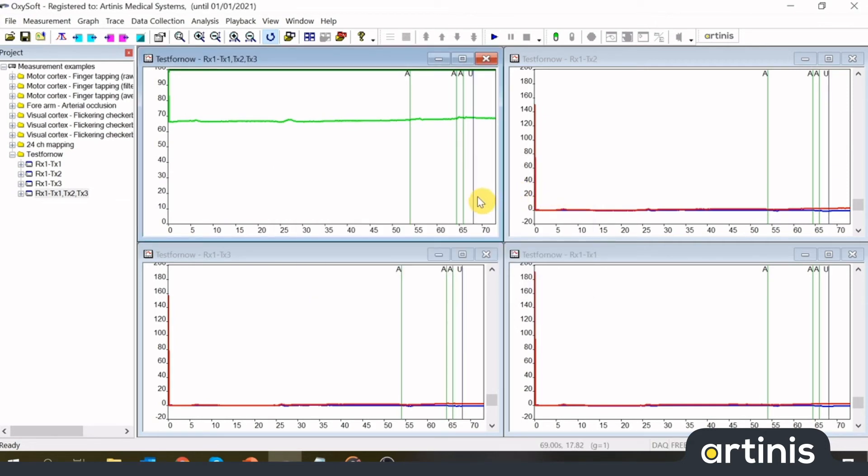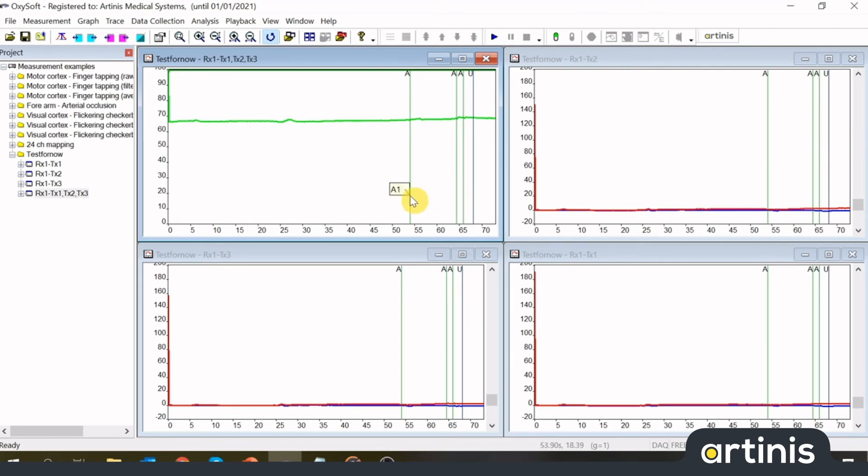Note that these events are placed within the measurement after data collection. In the software this is shown by a blue line, rather than a green line, which were placed during a measurement. As it is not possible to change raw recorded data, these new events are not placed with the raw data. These new events are placed within the project file.